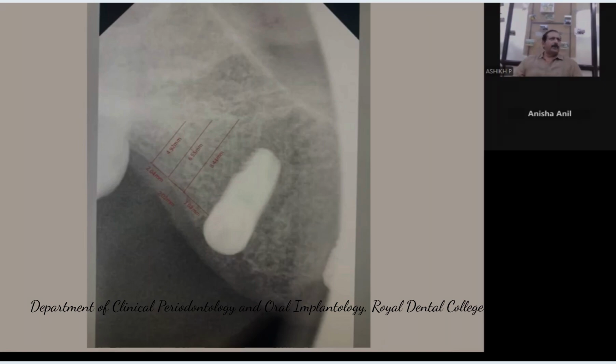So you go in for whatever incision is required, because in no way are you going to touch this implant on its outer surface or the borders of it or its thread or anything. All you could encounter is its platform area. That is okay. Because even if you expose that area with the vertical incision, you're going to expose the bone alone, not the implant.